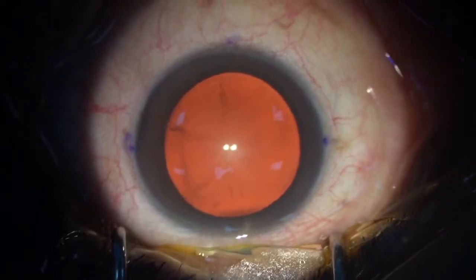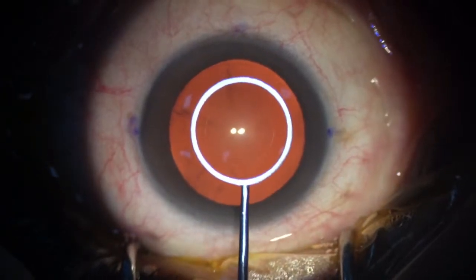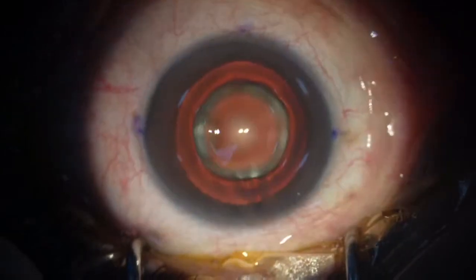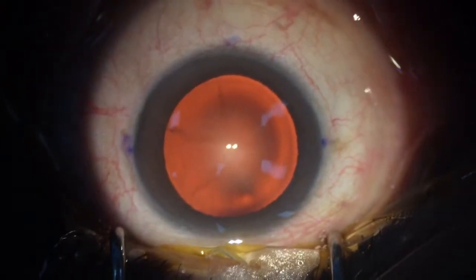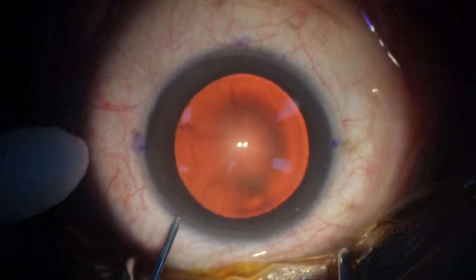Yes, what else? So I use a rexis marker for my rexis when I'm not using the Catalyst, and this leaves a good mark. Let's see. Side port. And it gives you a perfect rexis in the absence of a femto.